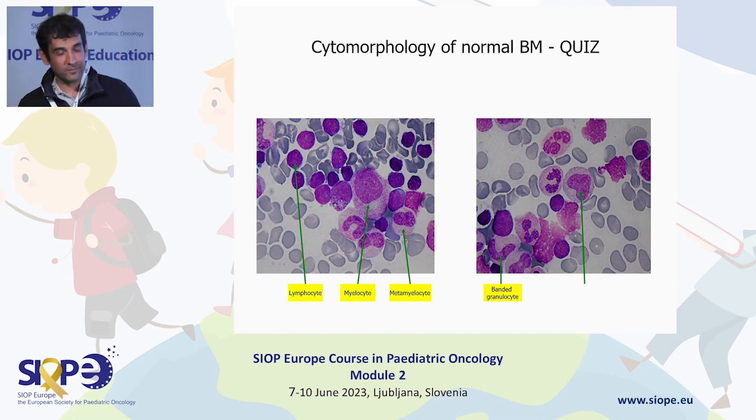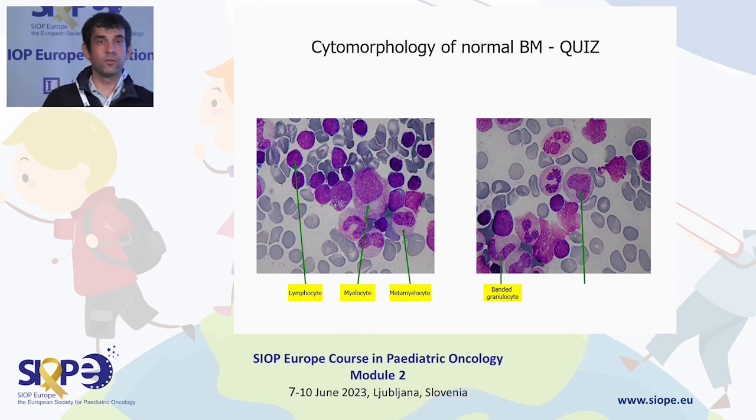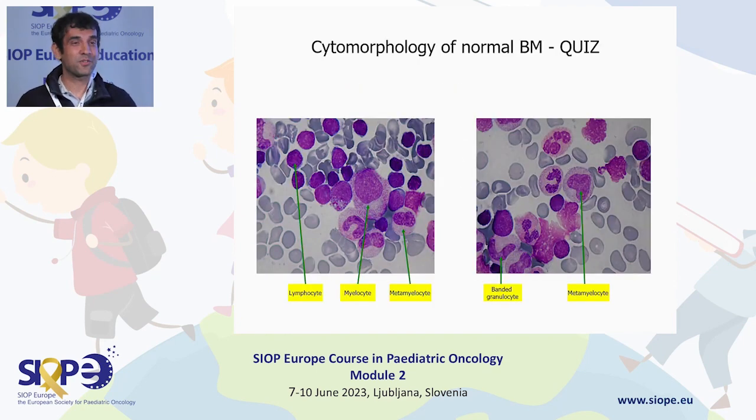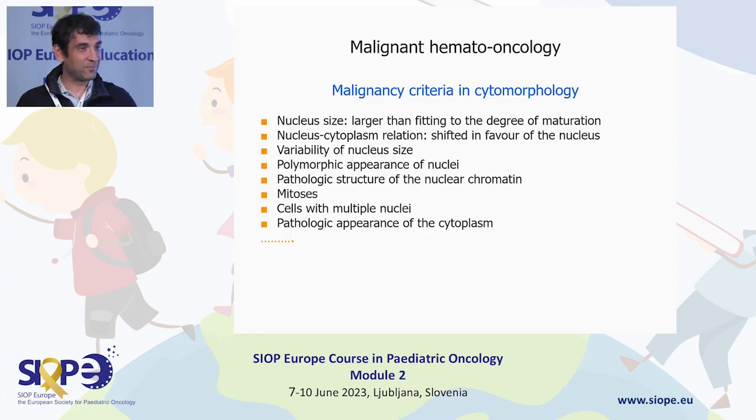Gray cytoplasm, very uniform. And the nucleus is not characteristic, but so it's... Monocyte? Yeah, correct, super. No, sorry, this was wrong. I would have also said so, but it's a metamyelocyte because you have the granules. This is my fault. Three of us answered that, so. Yeah. No. Good.